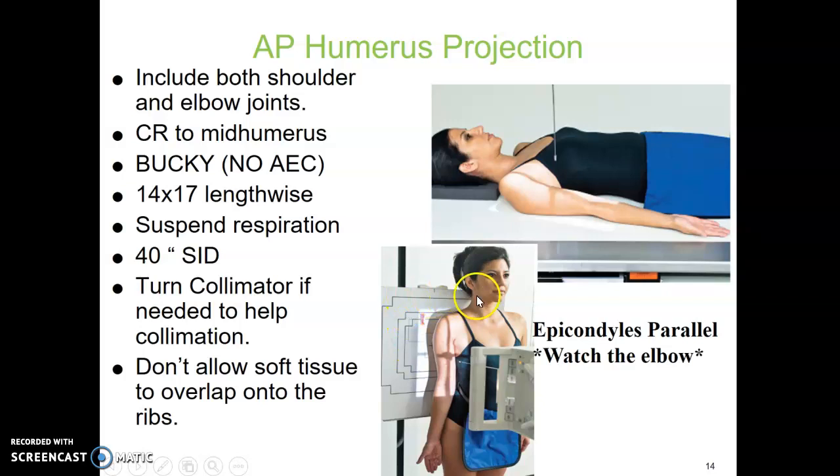In most rooms, you can turn the collimator and collimate more tightly to the arm. Try not to allow the soft tissue of the arm to overlap onto the ribs — bring the patient's arm a little bit away from the body. The epicondyles are parallel to the board. Watch the elbow; that's your key for the true AP humerus position. Don't allow the elbow to be in an external oblique position.